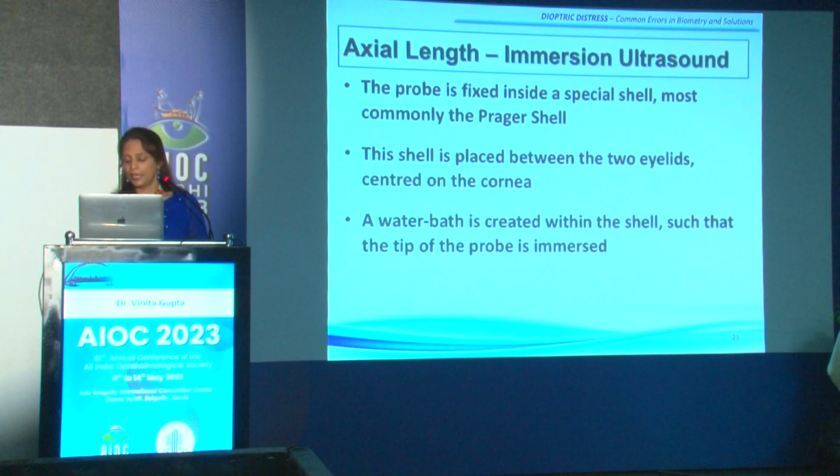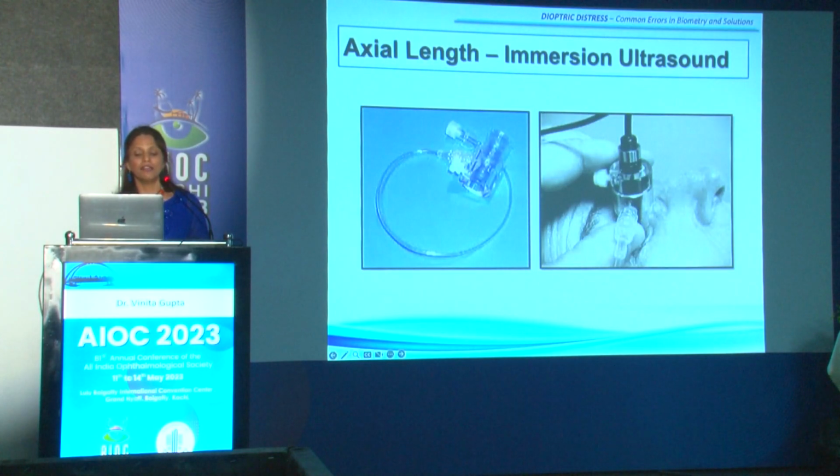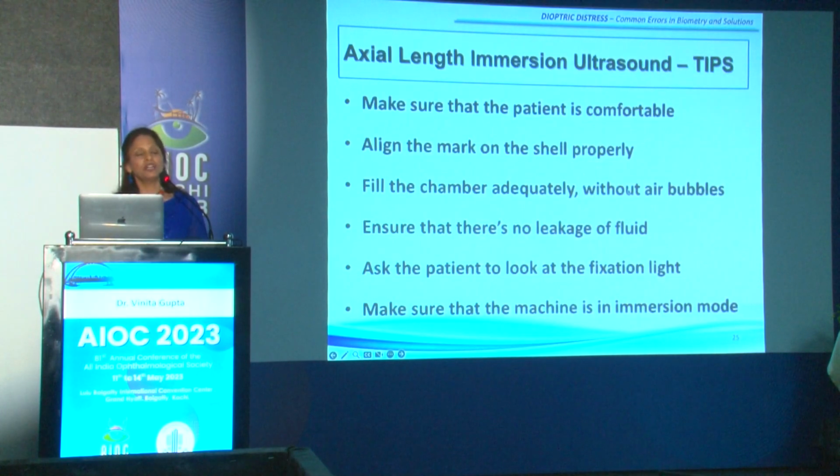This shell basically looks like this, where the water bath is created within the shell and the probe is immersed into this water bath, where the water is filled up to a level of almost 70 to 80%. And while doing immersion biometry, remember that the patient should be comfortable. So you can either keep the patient supine or even in the reclining position.